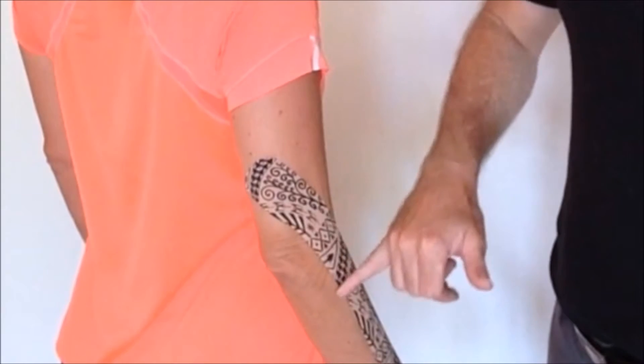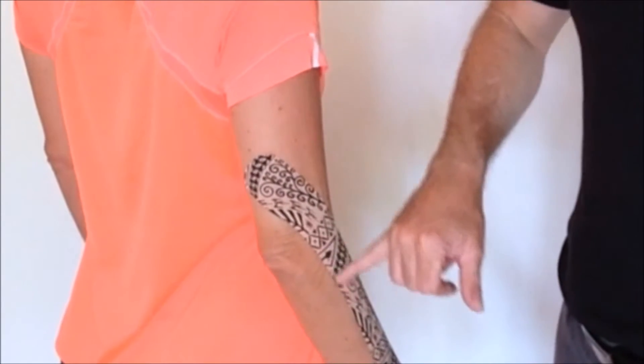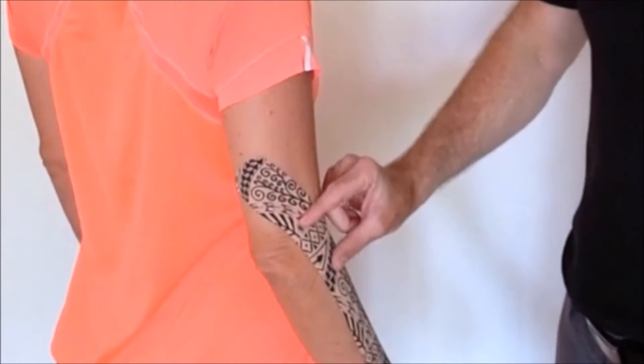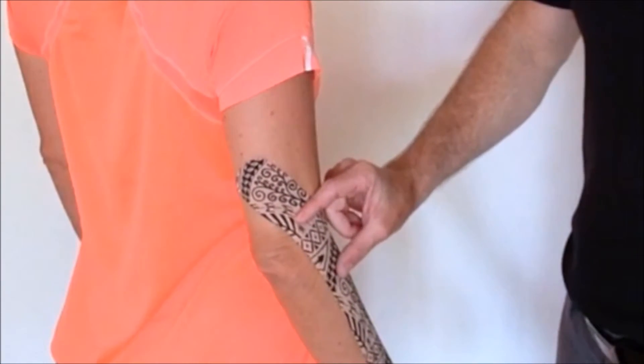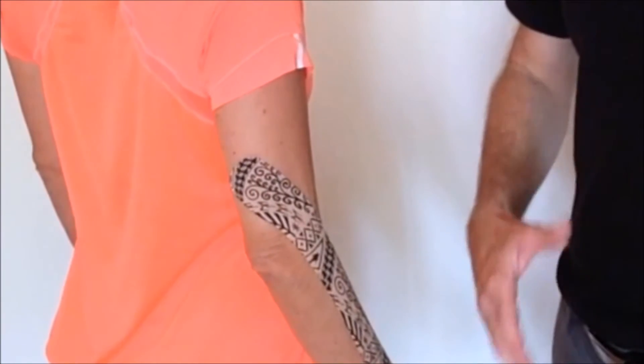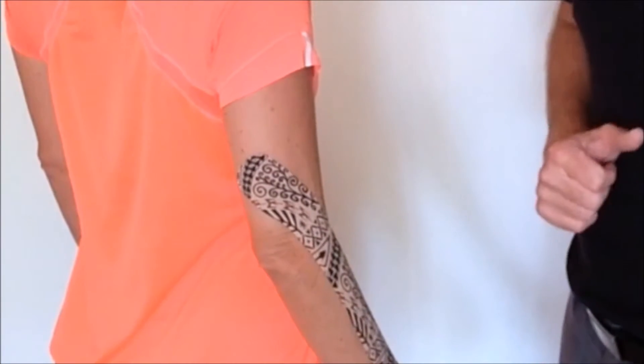Here you can see that gathering up and box taping effect, that pinch unloading we've created just by doing that pinch within the tape as we've come through. You can see the resting position of the hand has changed as well because of that resistance to flexion.